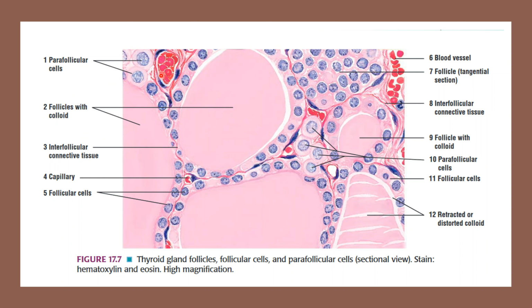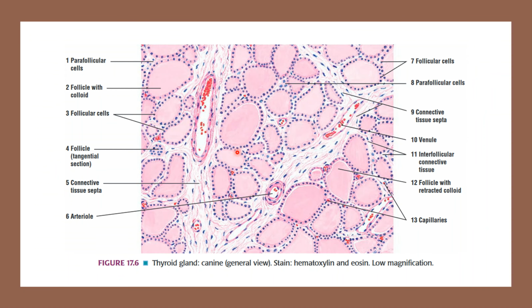Next, if you see inside, what is this? We can make out one eosin stained mass. In the previous slide also we can see in each thyroid follicle the eosin stained mass. That is called colloid. So this is colloid. If you take one follicle, you will have the basal lamina, then the follicular cells. Next, inside the lumen we can make out that colloid.